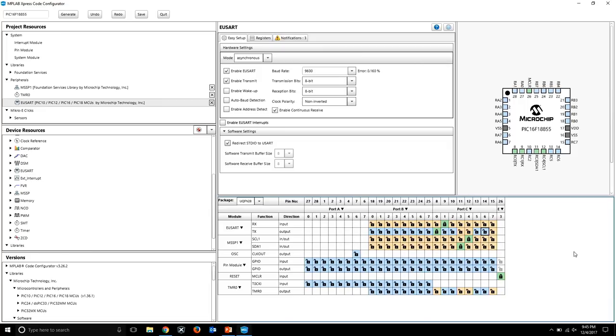Okay. So now we're going to generate code again, right? Okay. So once I'm done, I'm just going to hit generate code.